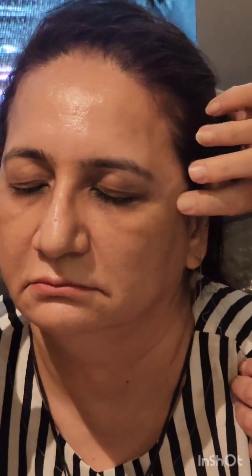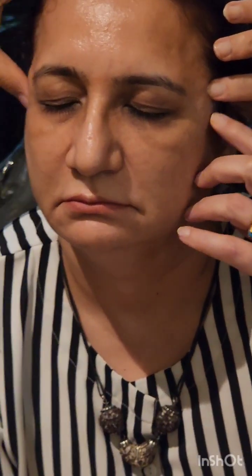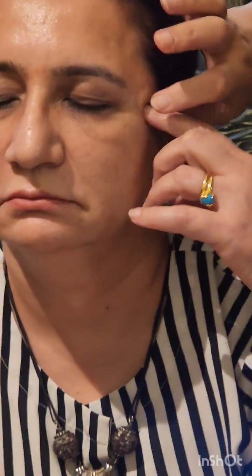Sorry, you can touch. I'll sterilize. Do you take any landmark from the angle of the eye? You can introduce it here. Just avoid the vessel. Lift and you see where you're getting the maximum.